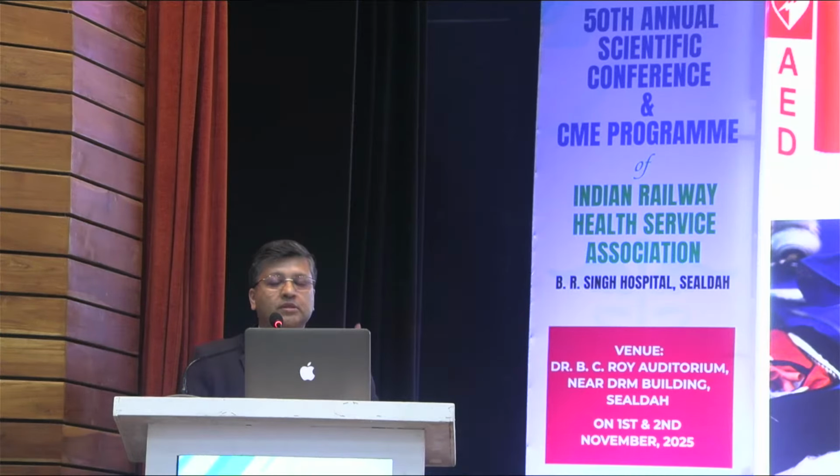So this is the defibrillator machine. This is the external defibrillator machine, both manual and automated. Automated is commonly used; there is nothing to do, just fix your patch, check your battery, and it will do its job. There will be no charge or discharge if the patient is having asystole. So it will also detect, but most automated external defibrillators don't have simultaneous monitoring where you can see the rhythm. The manual external defibrillator, you have seen everywhere.